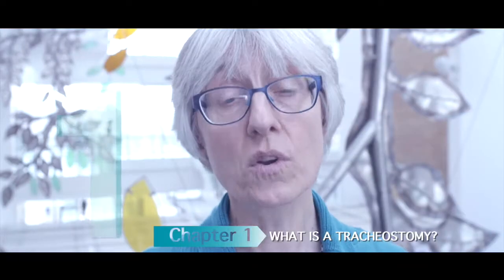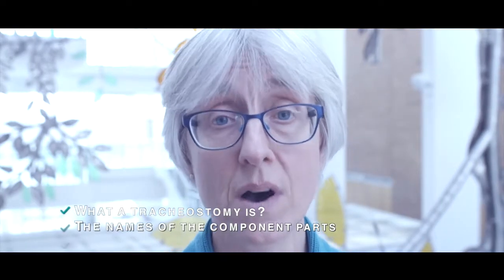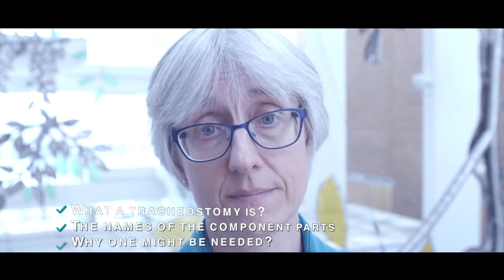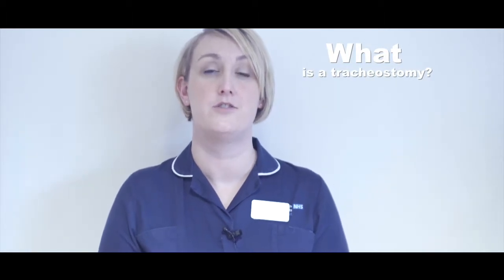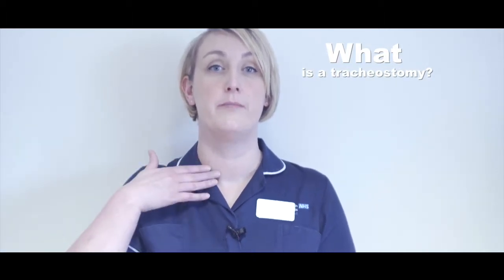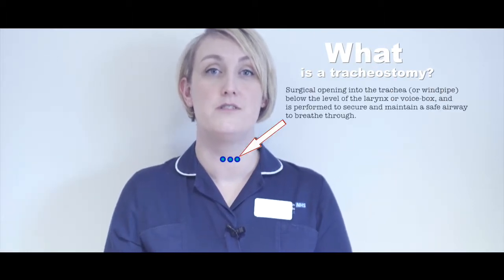Chapter 1: What is a tracheostomy? In this chapter we'll find out what a tracheostomy is, the names of the component parts, and why one might be needed. A tracheostomy is a surgical opening into the trachea, or windpipe, below the level of the larynx or voice box, and is performed to secure and maintain a safe airway to breathe through.